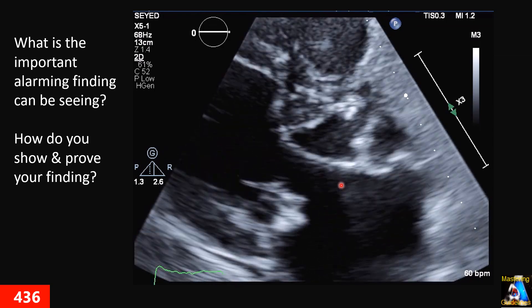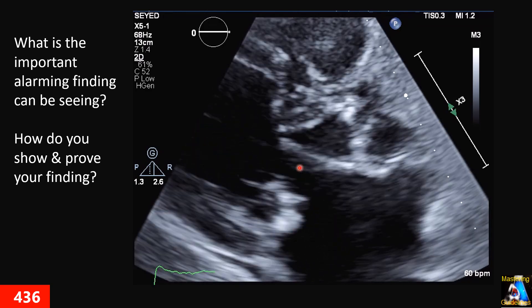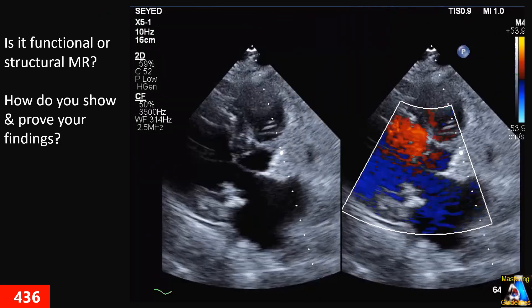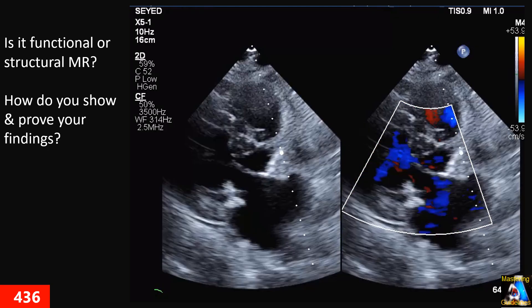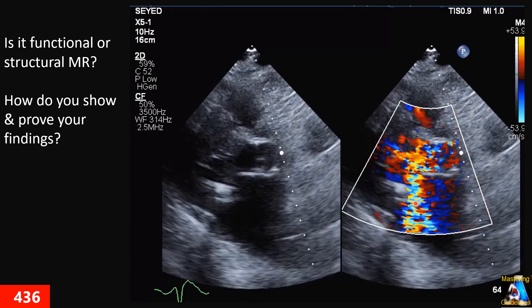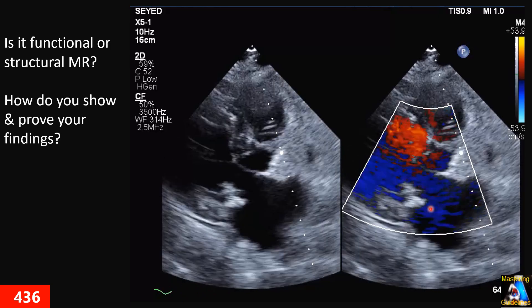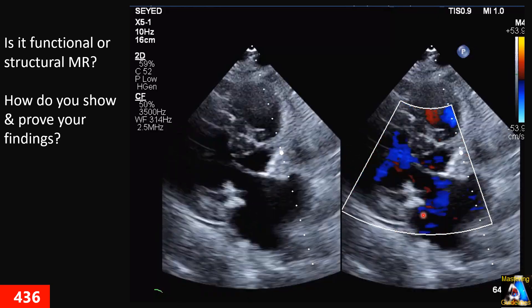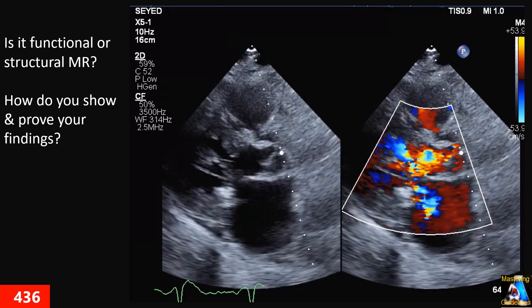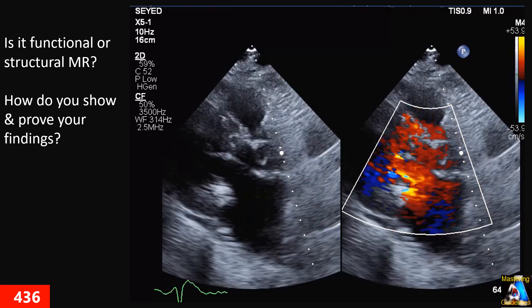What is the abnormal and important alarming finding you can see on this case? When you are suspicious — and you should be suspicious about that — how do you show it in your study and prove it? You put color on the mitral and aortic valve area and you see this color Doppler. Of course, we can see MR — how do you differentiate between functional and structural MR, and how do you show and prove your diagnosis? What modality and technique do you use in this step after this color Doppler?